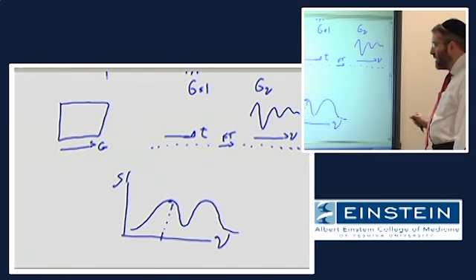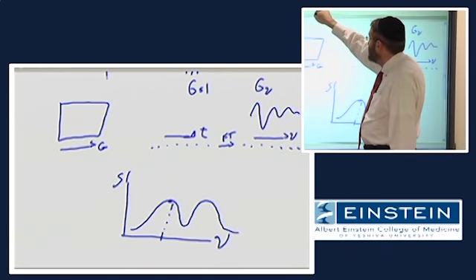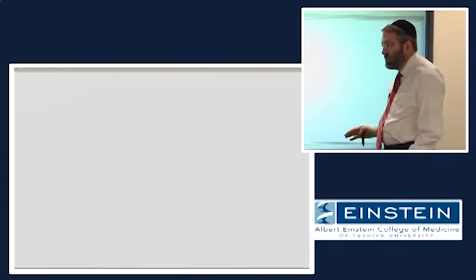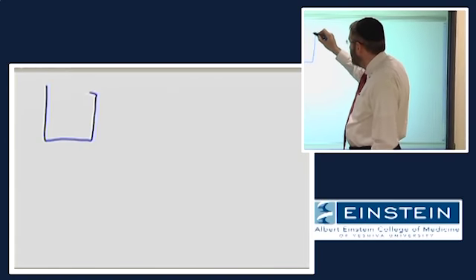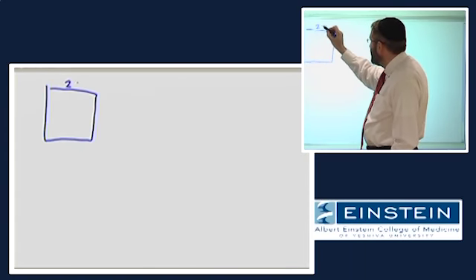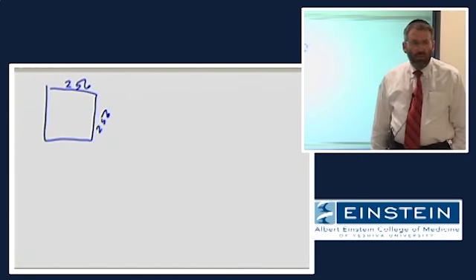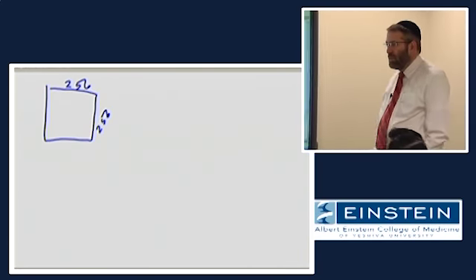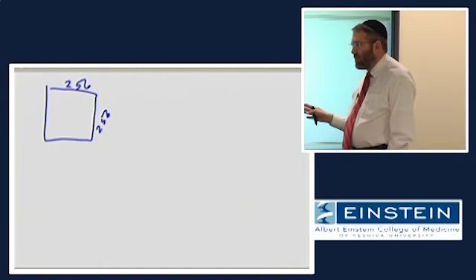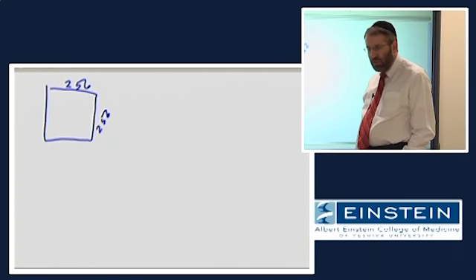Okay. So an example that I have in the notes is there just because people usually ask this question: if we would stop now and make an image. So my image is some array of 256 by 256 pixels. And I say, I'm tired, I don't want to go on anymore. Let's just make an image with the information that we have. So what would it look like?